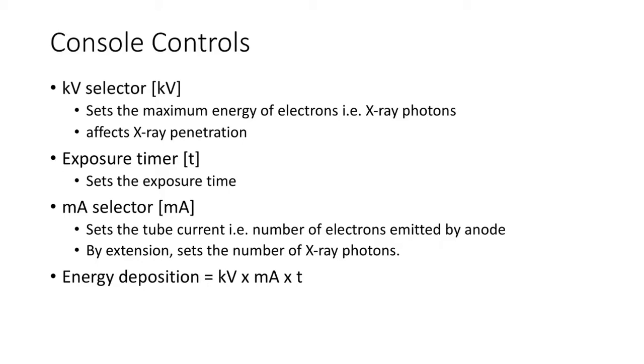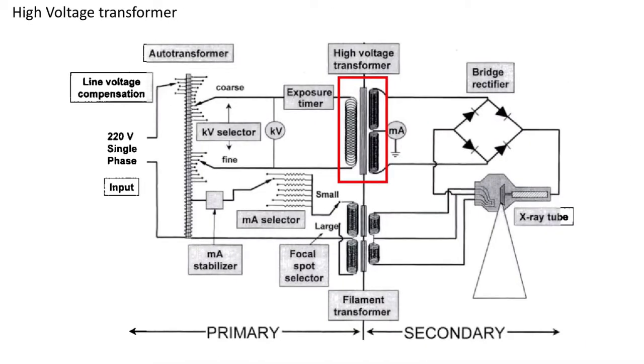Okay, so those are the controls. These are found on a console where the operator can set the parameters necessary for the exposure before beginning the exposure. And also, it should be noted, maybe let's go on to the next component, and then I'll highlight the note.